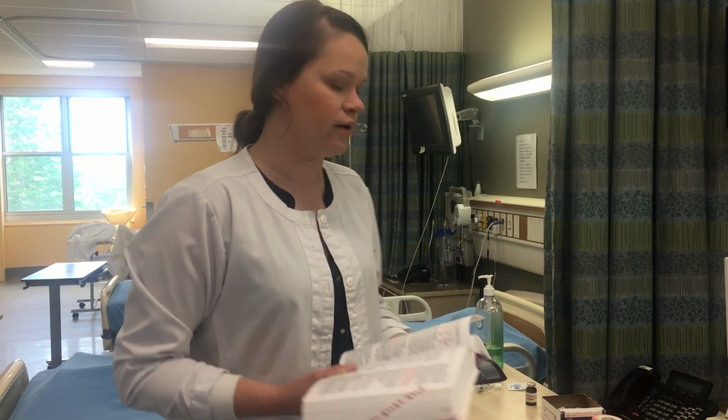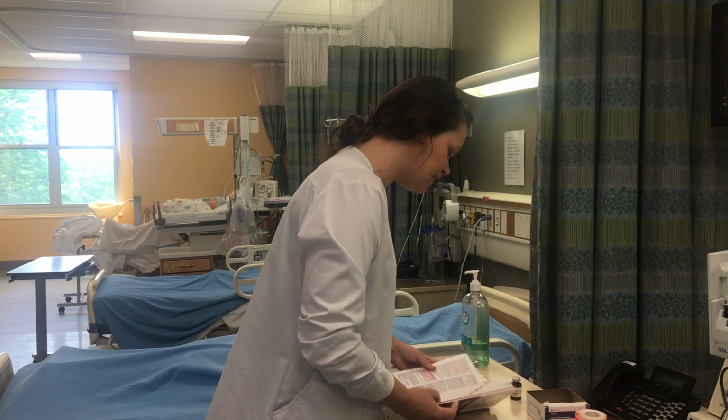For the basis of this video, I am not going to administer that over 1 minute, but keep in mind when you're in clinical, those are going to be some of the questions that your clinical instructors ask you. How fast are you going to push these medications? And why is that important? It's important because these medications are fast acting and they're going into the circulation extremely quick. So it's important that we know how fast to push it so we can eliminate potential complications.